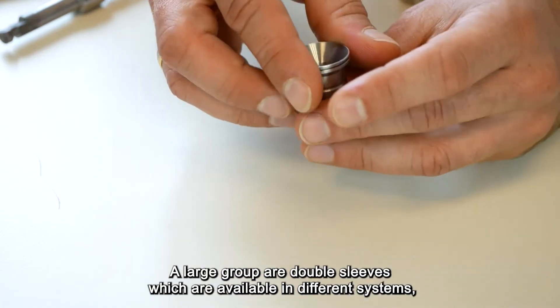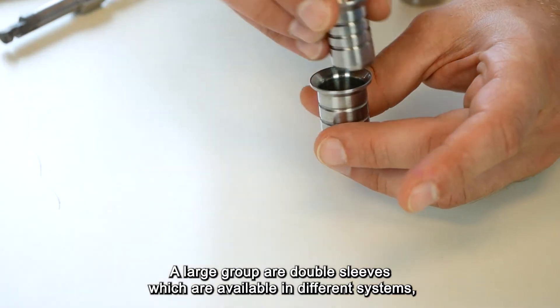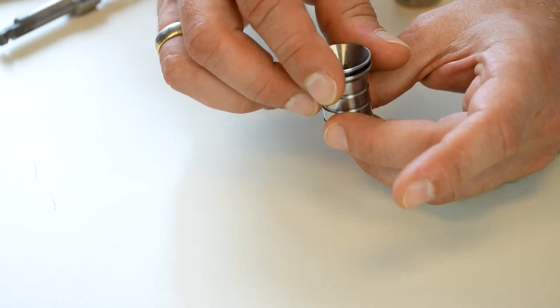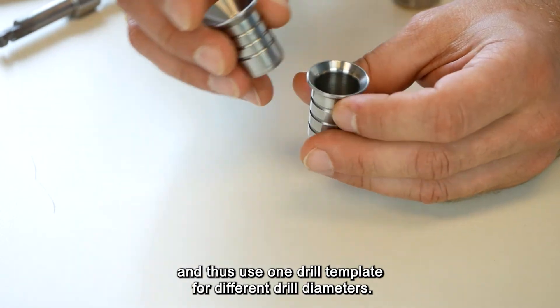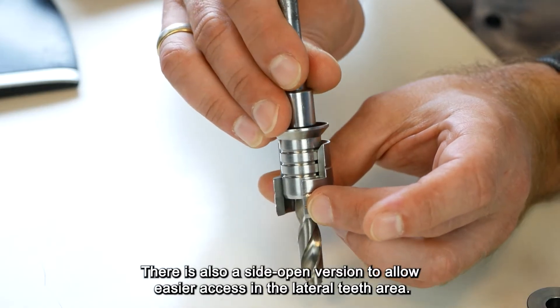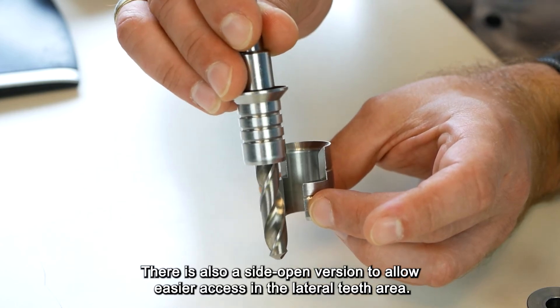A large group are the double sleeves, which are available in different systems and make it possible to guide different inner sleeves with one outer sleeve, thus using one drill template for different drill diameters. There is also a side-open version to allow easier access in the lateral teeth area.